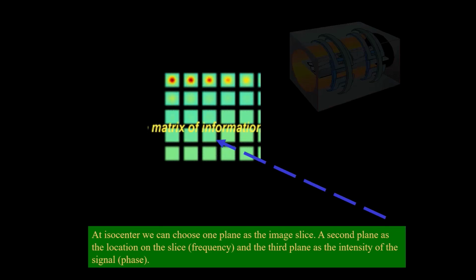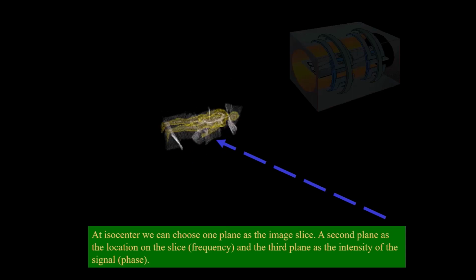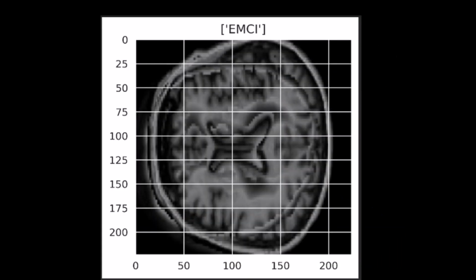It's like working with a color by number. Each pixel would be a number, and whatever the intensity is, the brightness, shade of gray or color, is mapped to that pixel. So we have the pixels, and we have their intensity, and we also have their brightness. What do we need next? Where are they? So the third point would be, where is that pixel in that matrix? When we put them all together like a puzzle, we have our image.